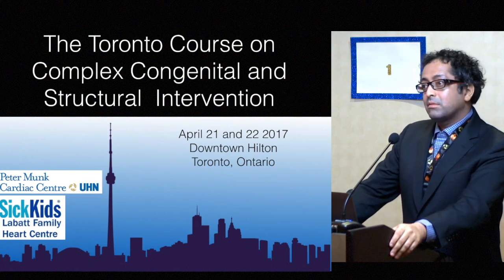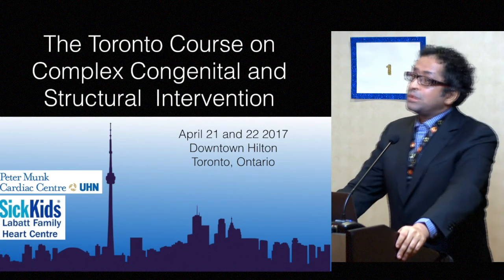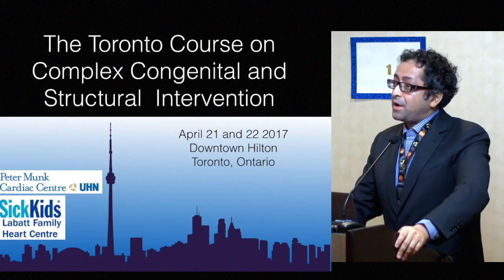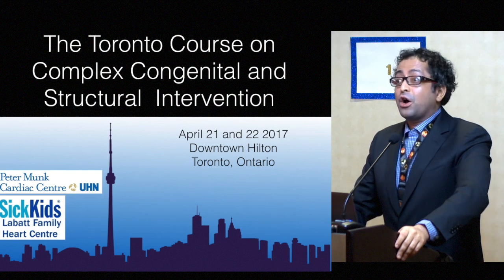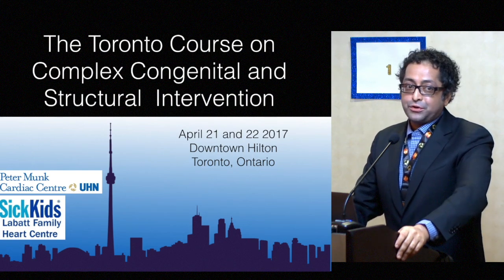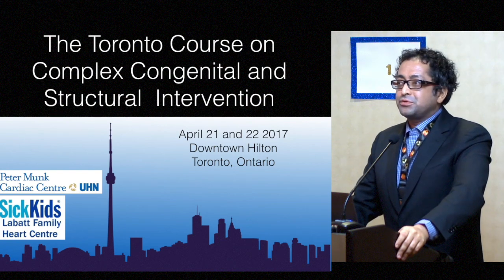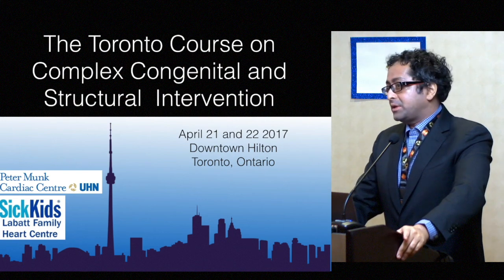So I'm just kind of interested though, how many now do you do transapical versus transseptal? That's a great question. At the downtown campus at Cornell, we still do about 75% transapical. On the uptown campus, it's the reverse. They're doing about 75% transseptal. A lot of that is discussion between what the different teams feel comfortable with, what their comfort level is.